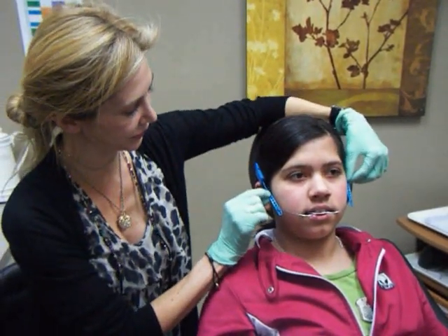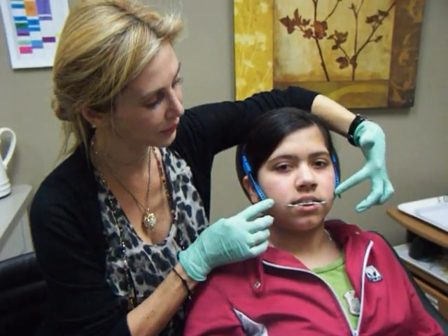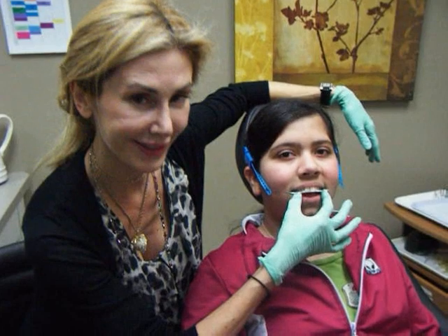These blue straps are elasticized, so they put an elastic force onto this outer bow. That force is then delivered to the inner bow, which is delivered to her teeth.